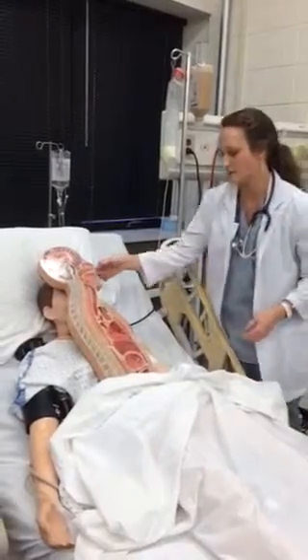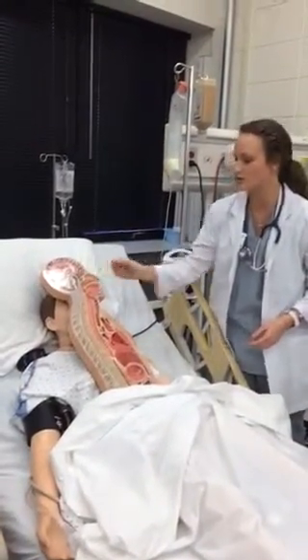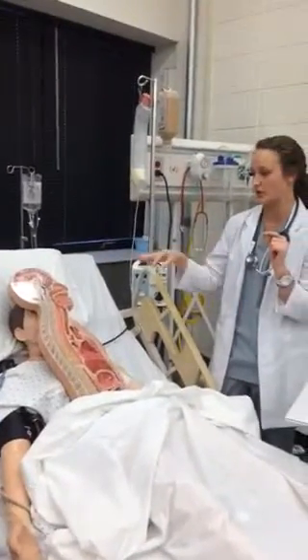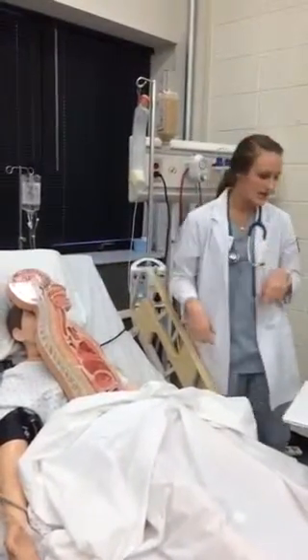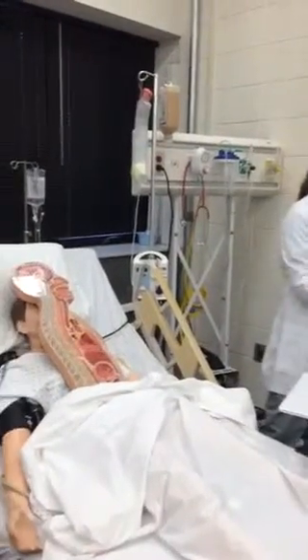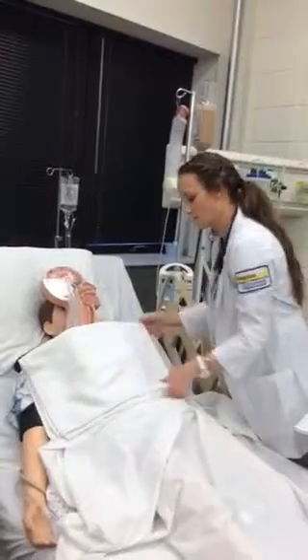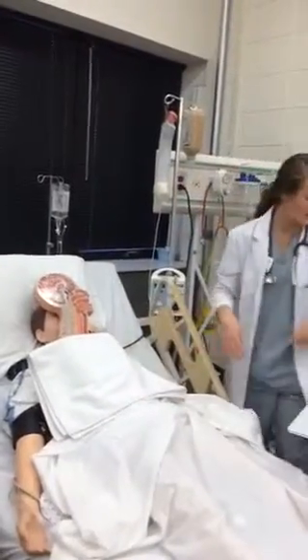And we're also going to assess the nares on the nose to make sure patency is good, whichever one we decide to do, and make sure there's no skin breakdown on the nares. And then I'll go ahead and put a towel over my patient's chest to get them ready. Put on my gloves.